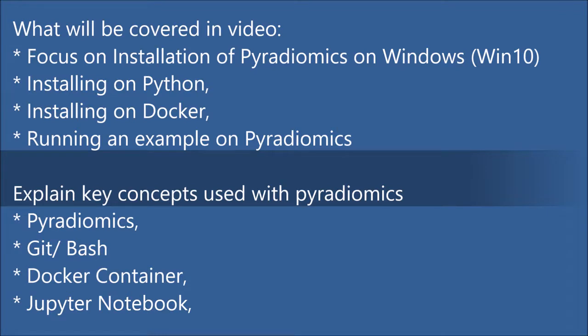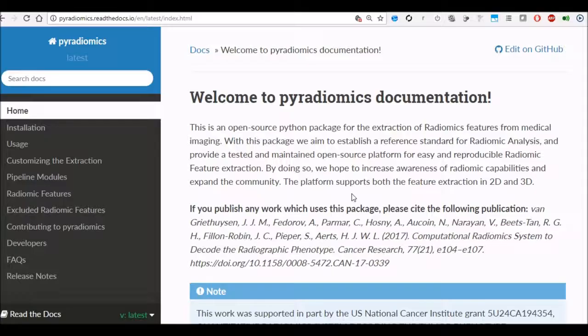I will be covering PyRadiomics, Git Bash, Docker container and Jupyter Notebook. So with that let's get started.